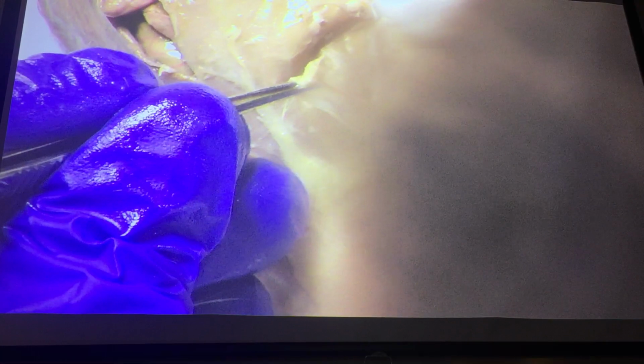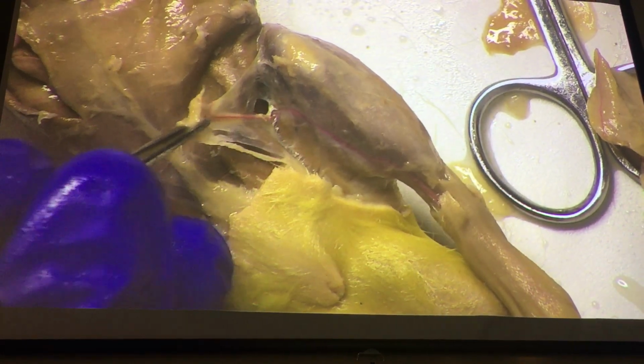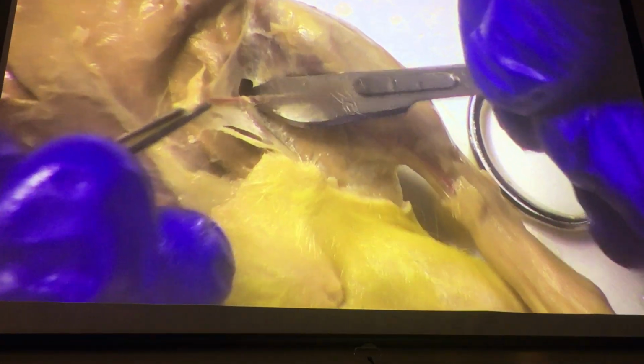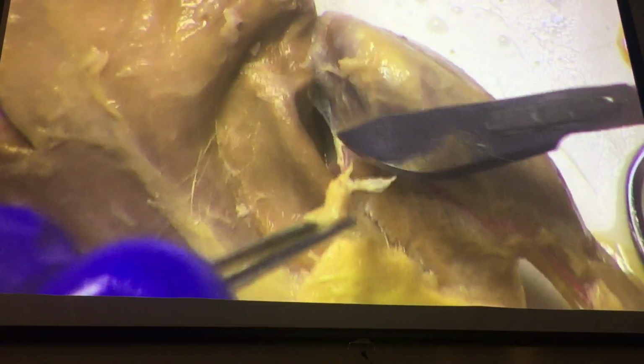There's an extra blood vessel here. You can see it actually went to the fat. This went to the fat pad that we removed, so this is the one big blood vessel you can easily snip away and not worry about it.